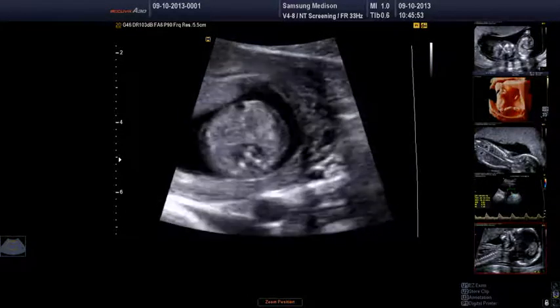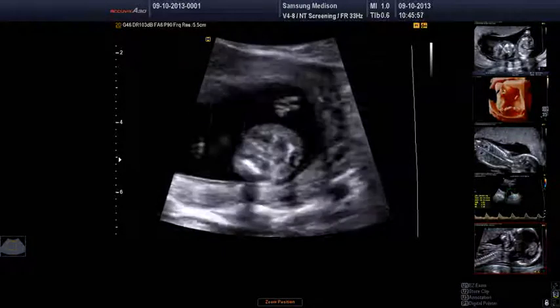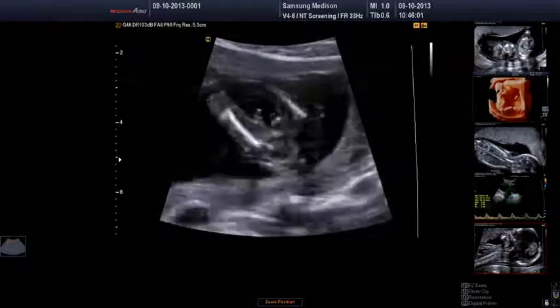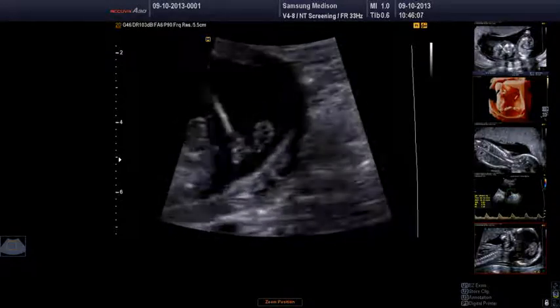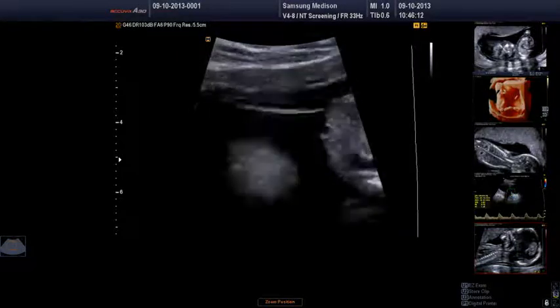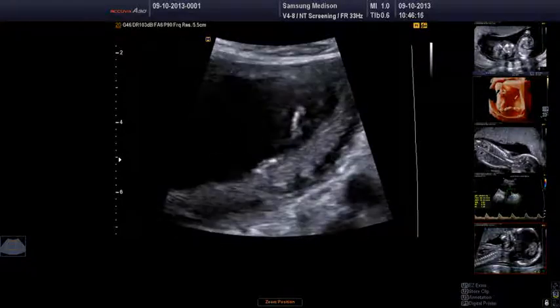Posteriorly, you can just see the two kidneys there. Bowel looks a nice normal colour to me. We can see the limbs, and being very careful to avoid anything else that might be in the area. Couple of feet down here, it's always useful.